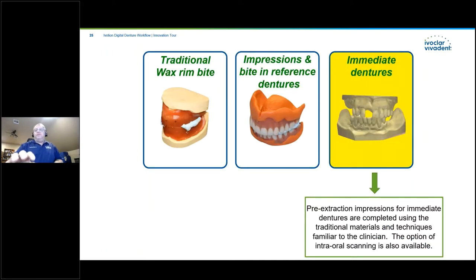The last workflow we want to look at today is going to be the immediate dentures. This is just going to be pre-extraction impressions for immediate dentures completed using the traditional materials and techniques that are really familiar to the clinician. Or you also have the option of intraoral scanning.